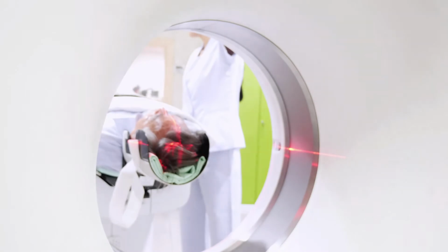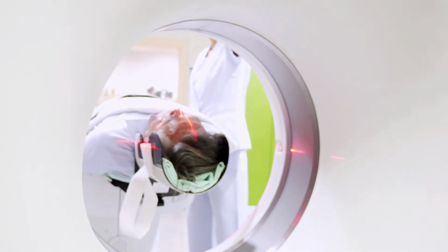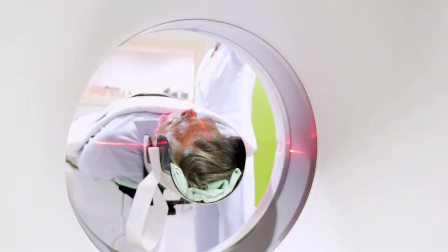Bone scanning and PET scanning can be used. They're primarily in this day and age for evaluating tumors and metastatic disease, which is important but not really part of sports medicine. In the old days we used to use bone scanning to evaluate for occult fractures, but MR is much more sensitive and more accurate than bone scanning, so we pretty much no longer use bone scanning for looking for occult injuries.